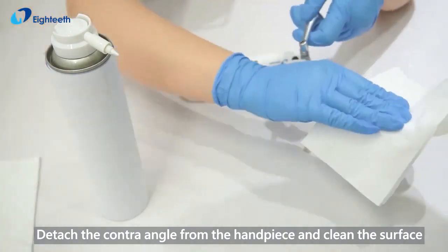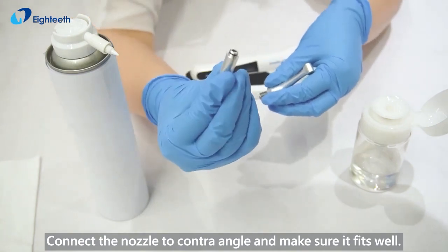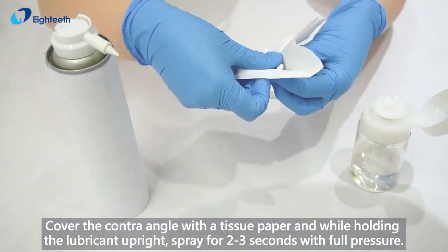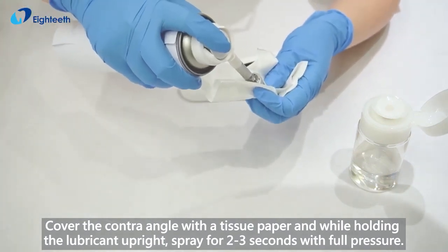Remove the handpiece and clean the surface. Connect the nozzle to the contra angle and make sure it fits well. Cover the contra angle with a tissue paper and, while holding the lubricant upright, spray for 2 to 3 seconds with full pressure.